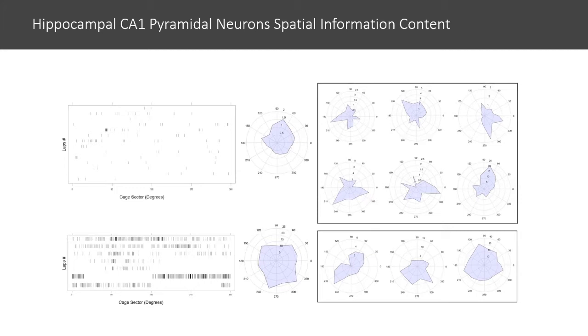To address whether the spike activity of recorded neurons encodes spatial information content, we plot the spike frequency according to the animal's angular position in the mobile HomeCage. Here we have analyzed recordings where the mouse made at least 5 laps and evaluated only exploratory periods. On the top, you can see up to 7 examples where recorded spikes showed a certain degree of preference regarding the animal's position. However, not all the neurons seem to encode spatial information content, since their action potentials were regularly distributed on the behavior arena.